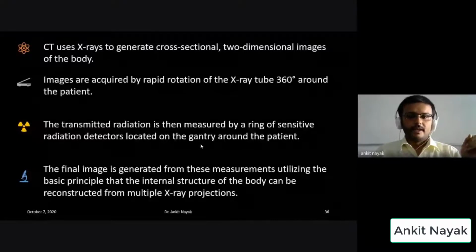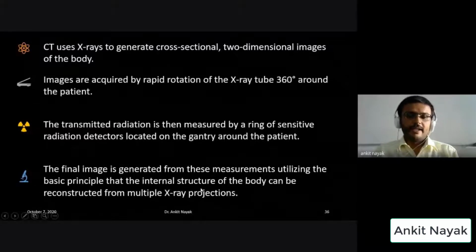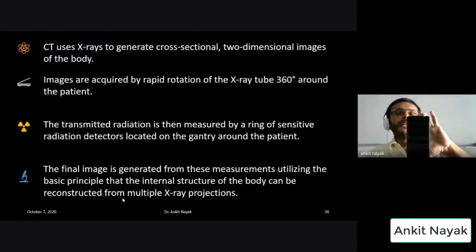So the sensors, the radiation detectors, are located on the gantry around the patient, and the final image is generated from these measurements, utilizing the basic principle that the internal structure of the body can be reconstructed from multiple X-ray projections. If I tell you to do the 3D modeling of this phone, and I supply you only the front view, it is quite difficult to do.